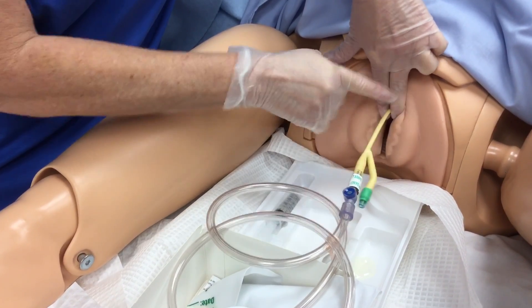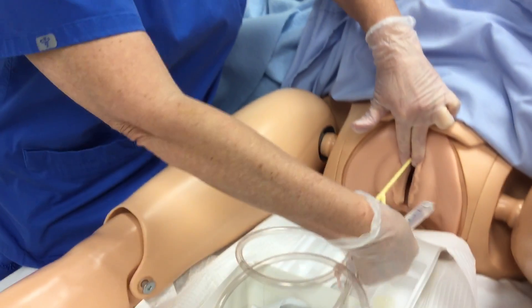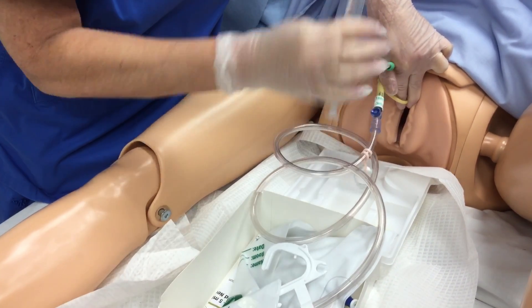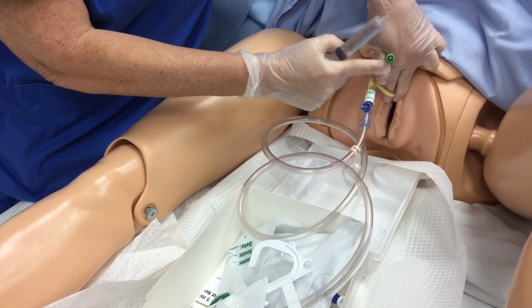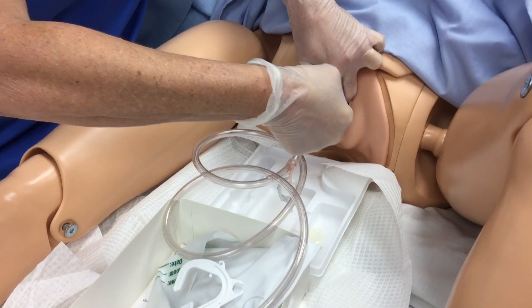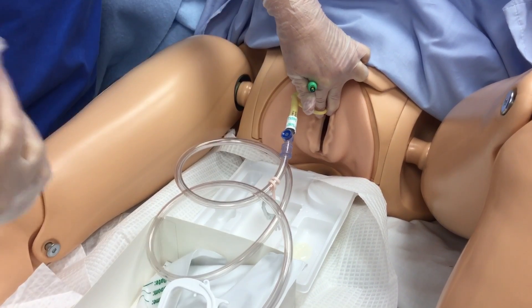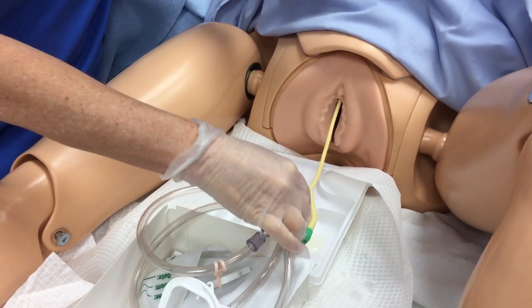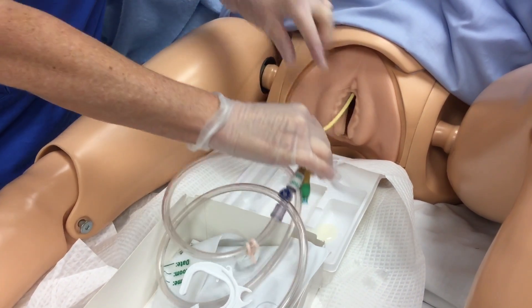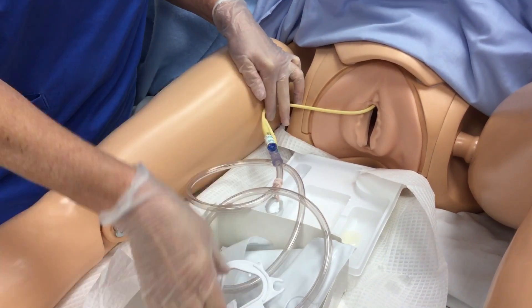With your dirty hand, anchor and hold the catheter. You may already have the drainage bag hooked to the catheter — that's fine. Then fill the balloon and pull off. Remember to keep pressure on the end of the syringe as you pull the syringe off. Then you're going to back it up until you meet resistance, and go under the leg and hang it on the side of the bed. There will be something to anchor it to her thigh — it's usually in the kit.